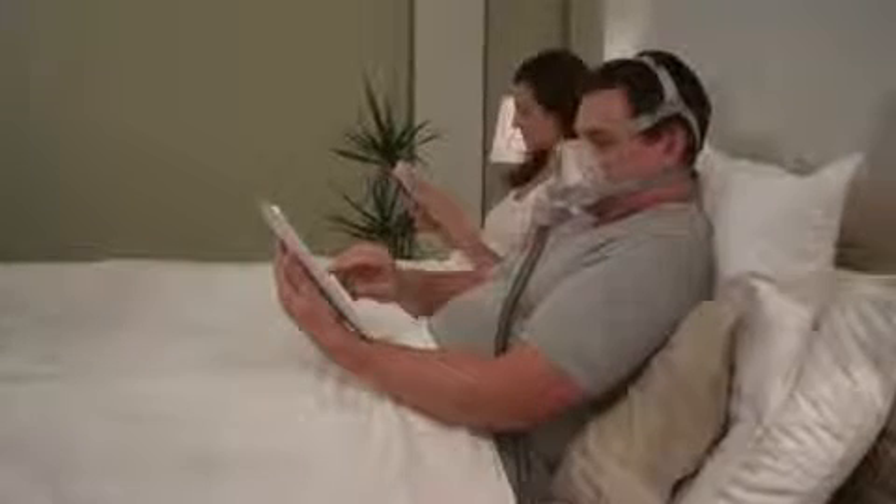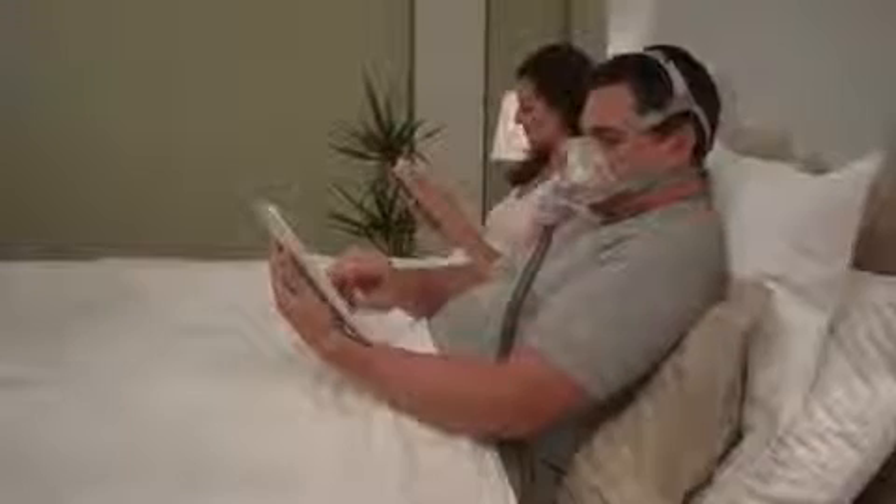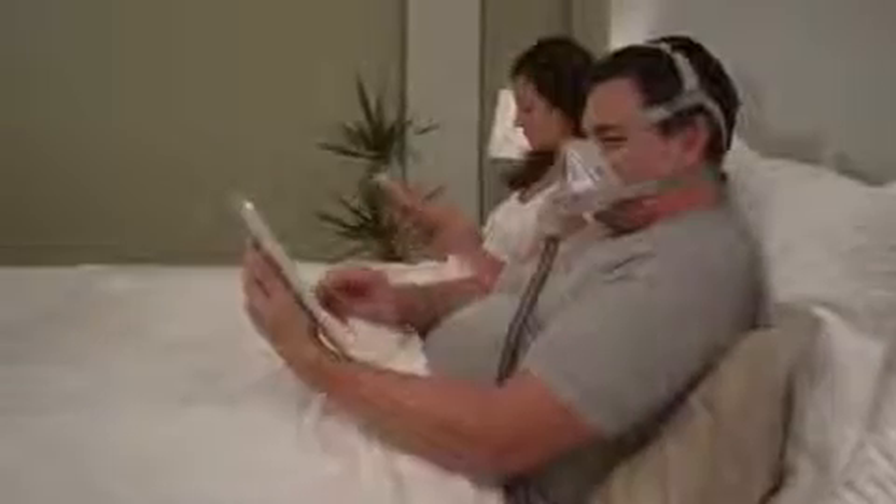The AirFit F10 is unobtrusive by design and provides you with uninterrupted vision. So when you're wearing the mask, you can read, watch TV, and even wear glasses while your therapy is ramping up.